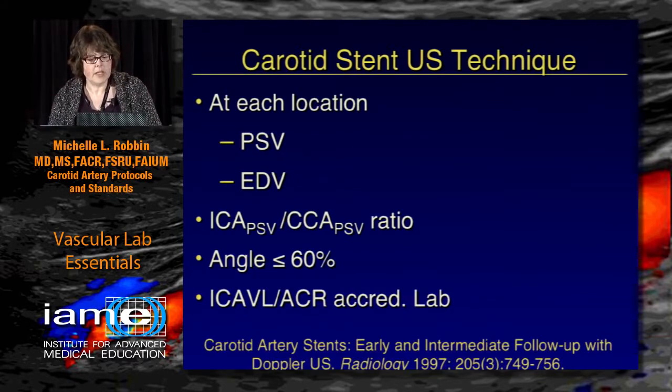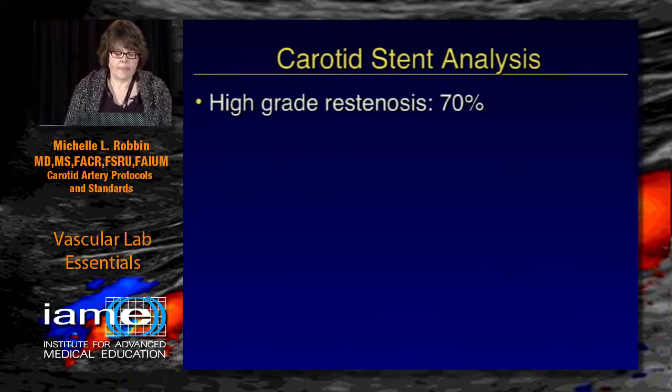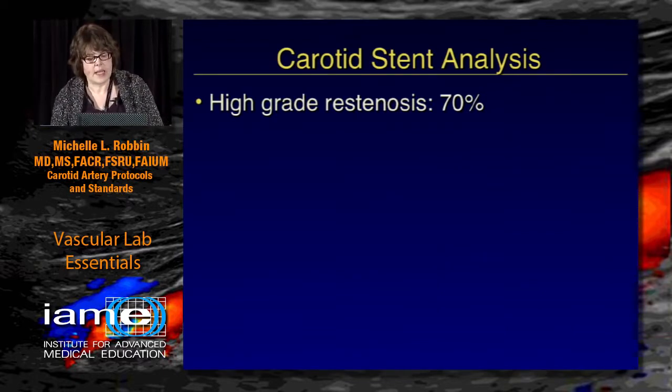That was way back in 97. Now many other studies have been performed, and it's still kind of hard to determine what is the exact good cutoff to call a stent restenotic.